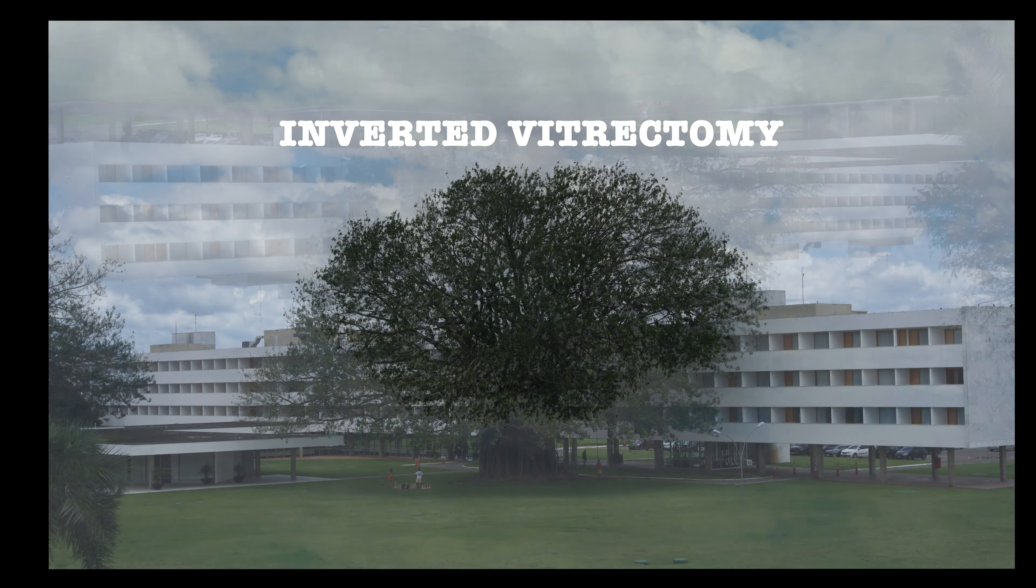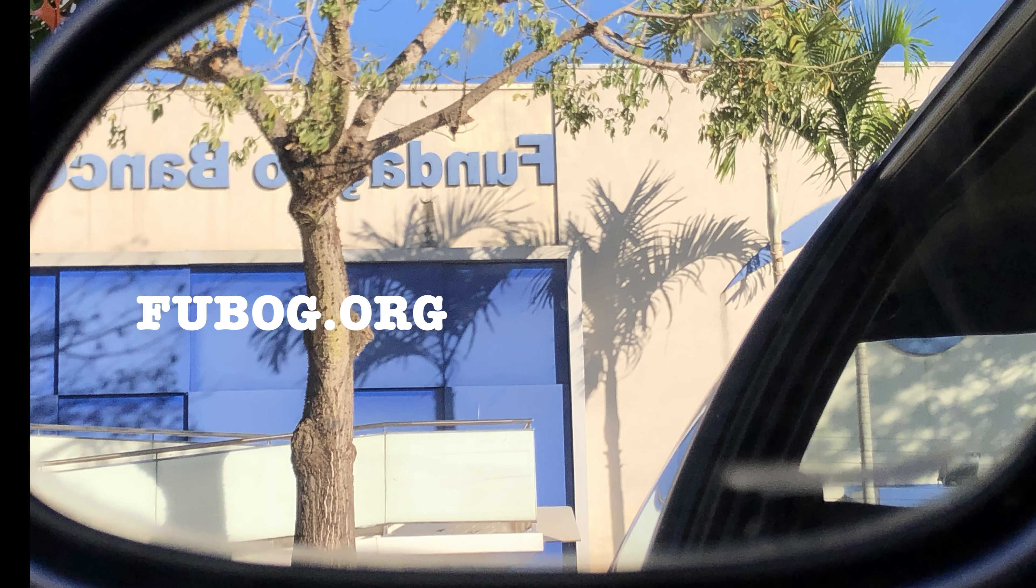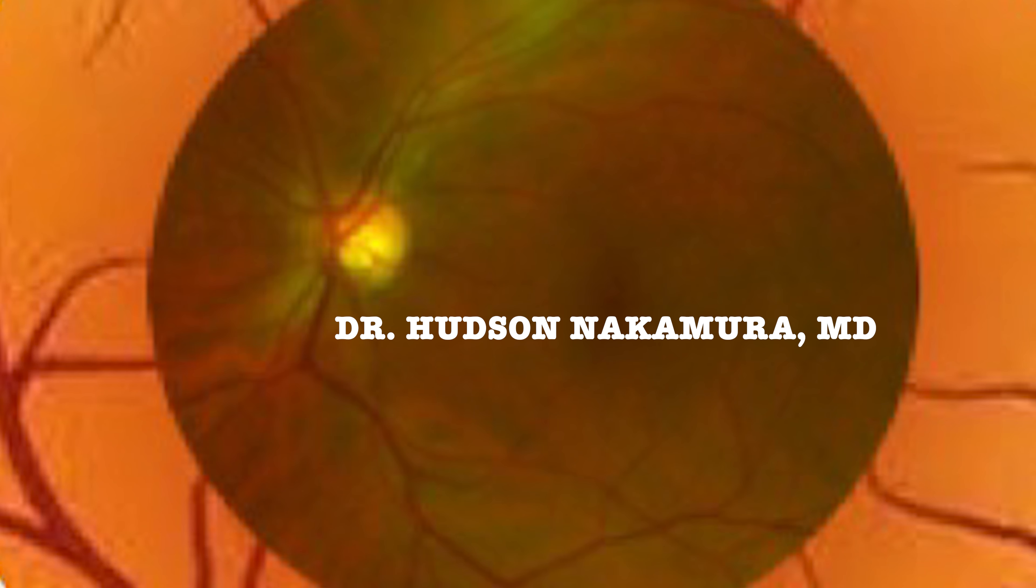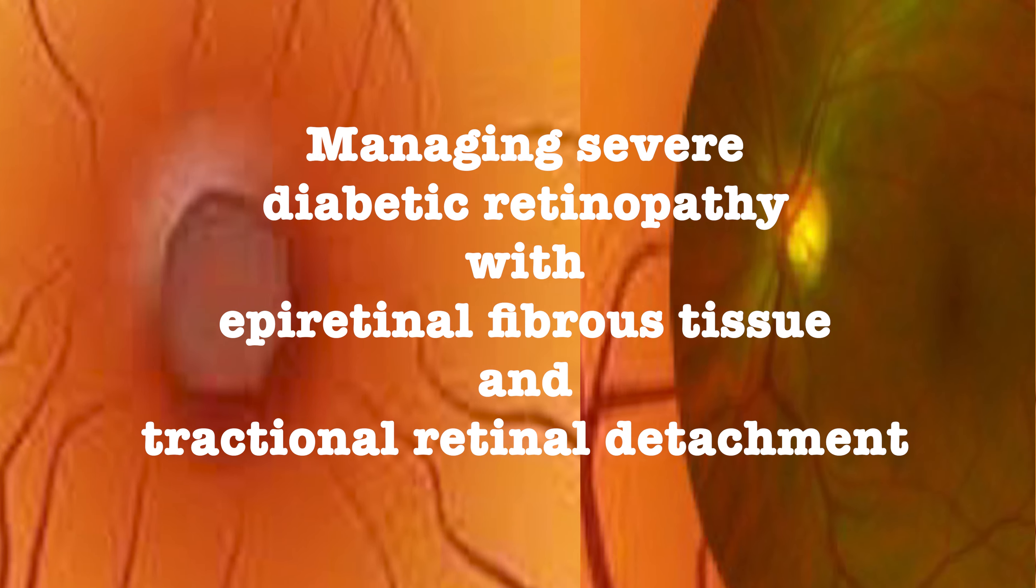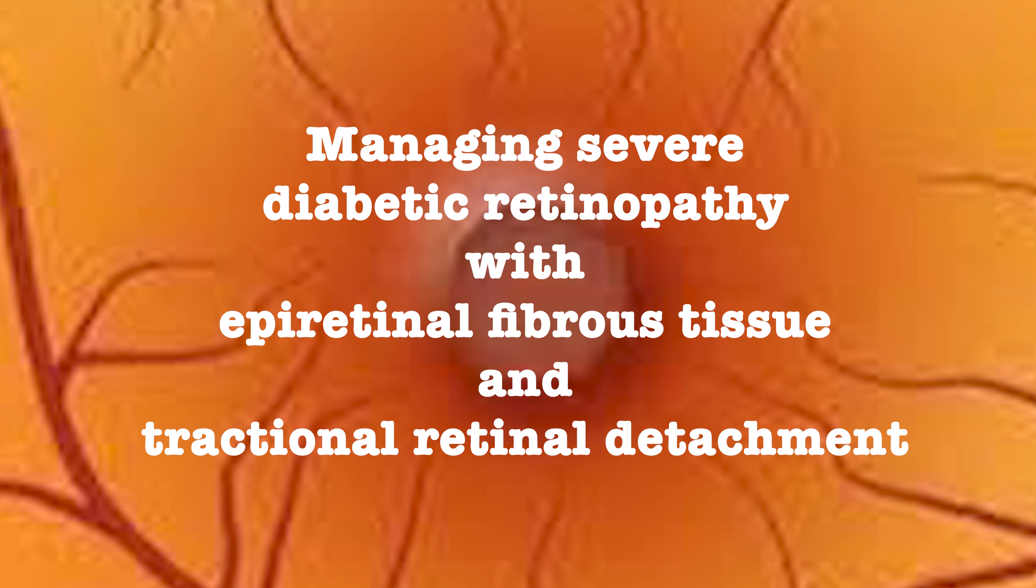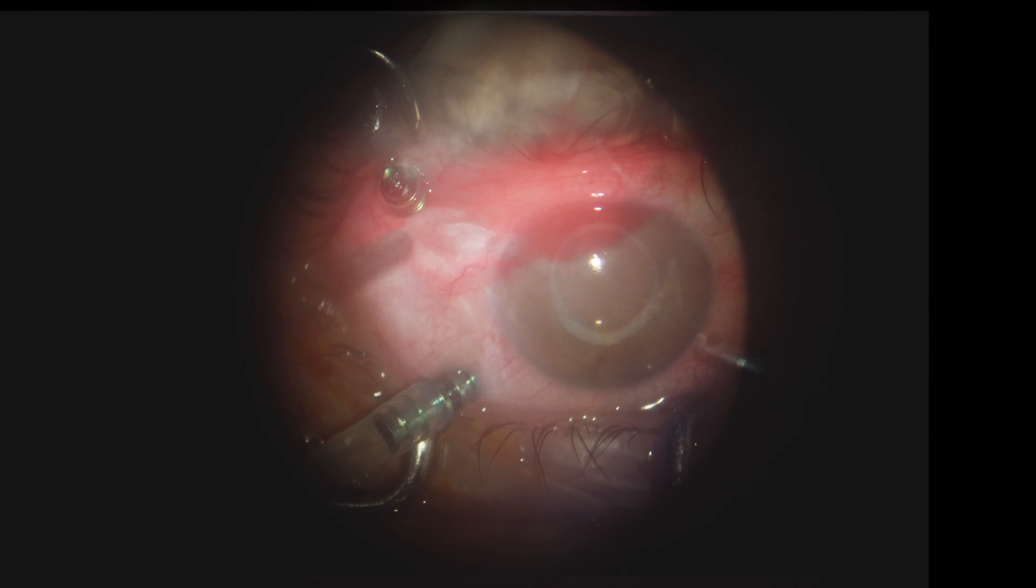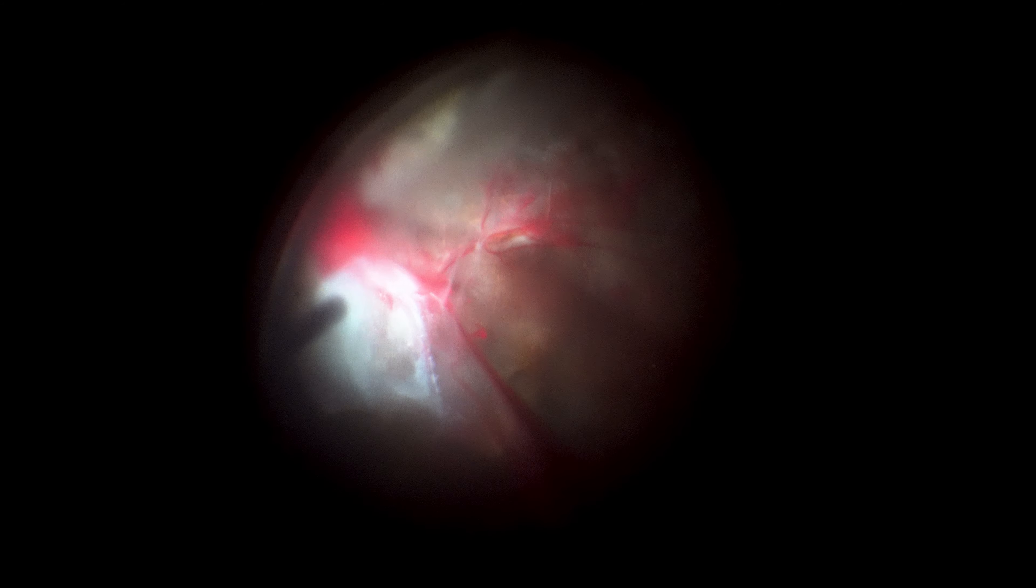This is an inverted vitrectomy managing severe diabetic retinopathy with epiretinal fibrous tissue and tractional retinal detachment. The patient is pseudophakic. This is a 23-gauge pars plana vitrectomy. There are numerous neovessels covered by massive preretinal bleeding together with fibrous tissue on the macular surface.